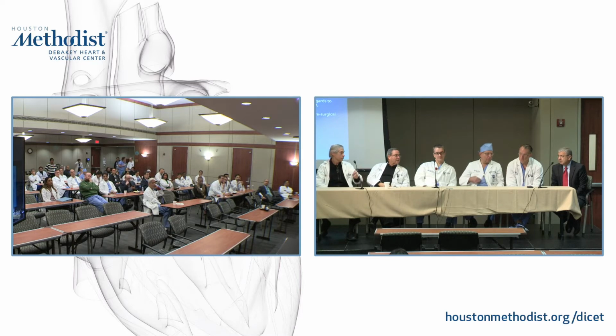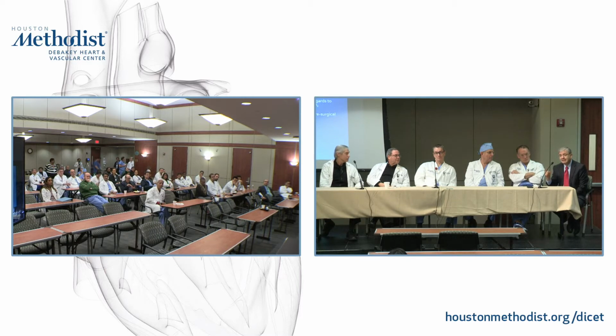So Tom has a very good point, meaning, for the imagers, that not infrequently, depending on the ventricular size and function, there's a vortex in the ventricle. The phenomenon you're describing, Tom, is more often in late diastole, where a vortex comes into the ventricle and almost closes the medial leaflet of that valve. So it is not a dysfunctional valve. It opens up completely normally, but because of the vortex, depending on the situation, you will see that.